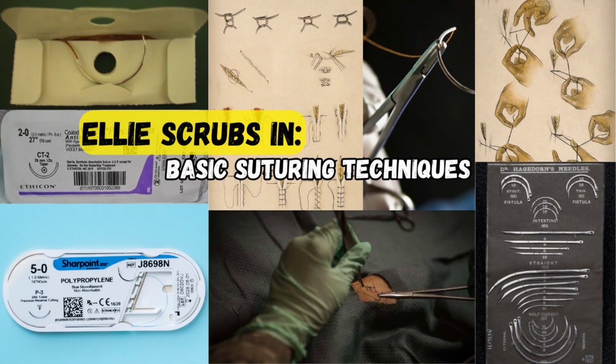That is the basic suturing toolkit. Control the needle angle to control edge position. Keep bites symmetric when the edges are symmetric. Use buried dermals to offload tension and hide knots. Protect corner tips by supporting them from underneath. Adjust skin tension with a slip knot before locking it down. And use a vertical mattress when eversion and edge support are needed.